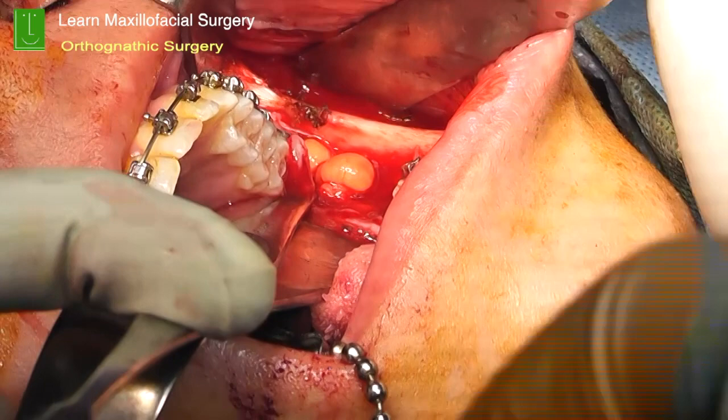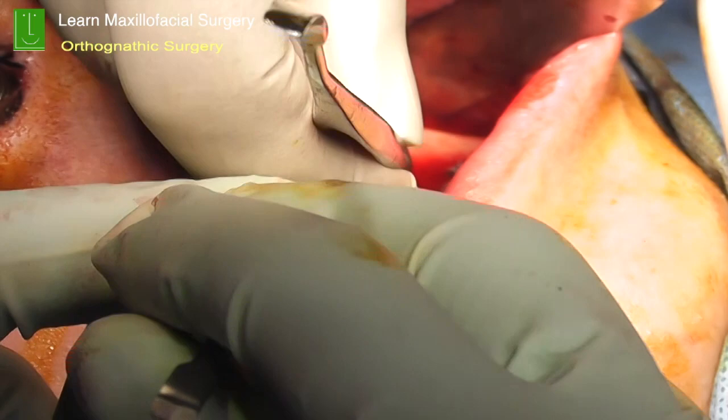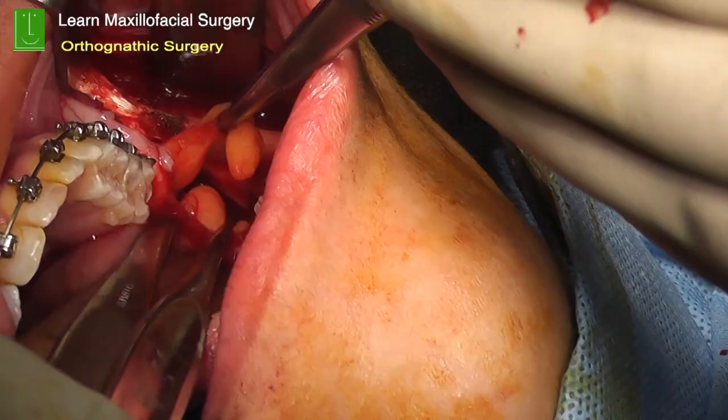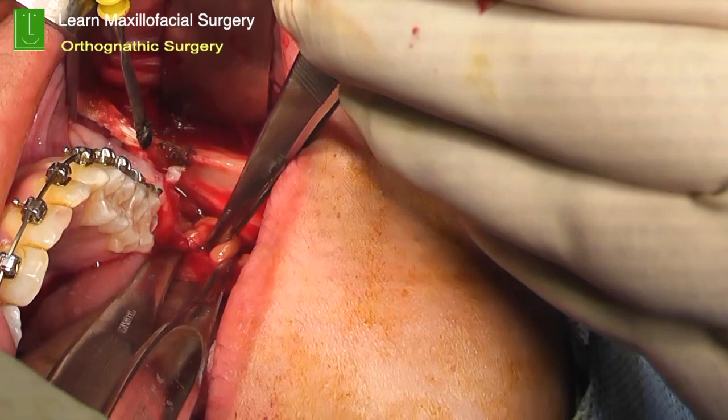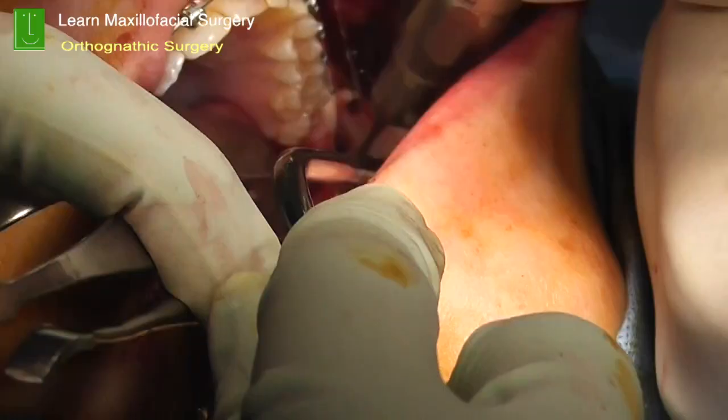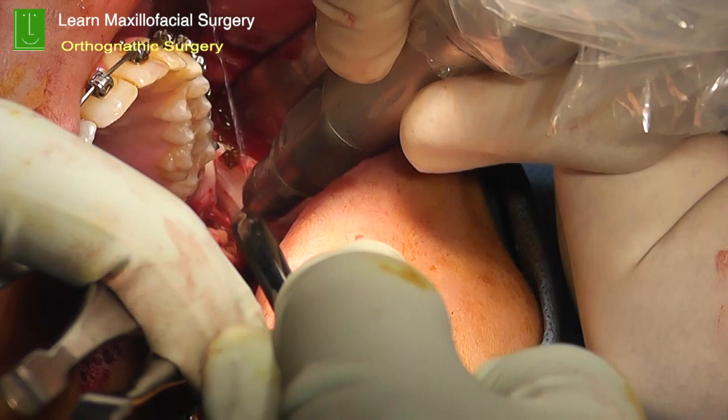That's a bit of fat which you can see sometimes it herniates in the pterygomandibular space. That can be very easily removed. With cautery, you can just take it out, or gently you can tease it out with the scissors so it doesn't come in the way when you're making your cuts. The key is your lingual retractor, usually the Howarth's periosteal elevator, which is abutted. Many a times you use two of them so that you get good access onto the lingual aspect.